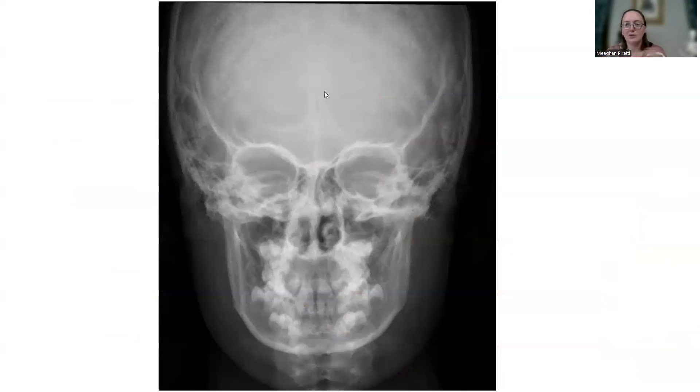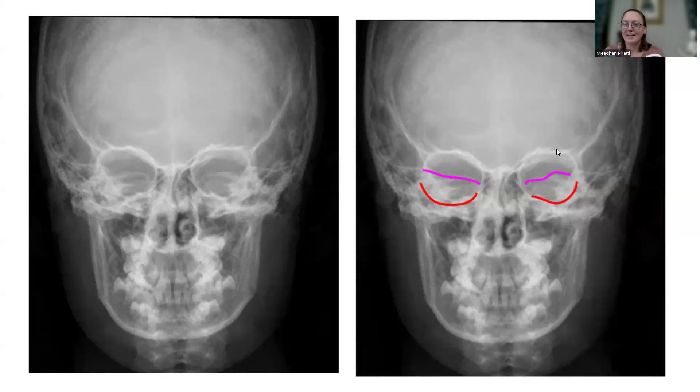Here's our image to critique. This is supposed to be a Caldwell facial bones view. I want you to identify where the petrous ridges are — find your orbits, make the circle, and find the ridge. Here's one, here's the other. Would you consider that to be in the lower one-third of the orbit? I wouldn't — it's really right in the middle of that orbit. The coloring shows the red at the bottom of the orbit, and the petrous ridges are here in the midline.